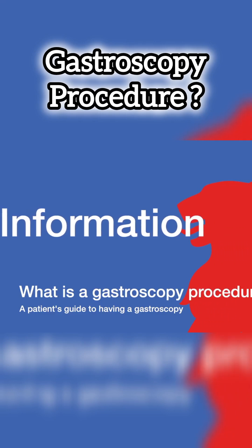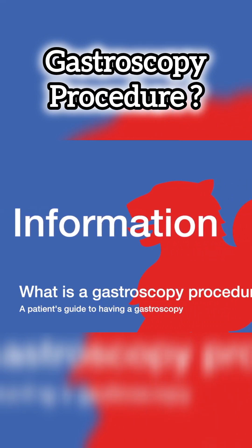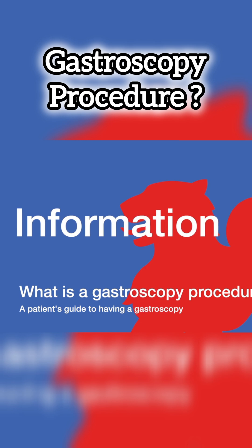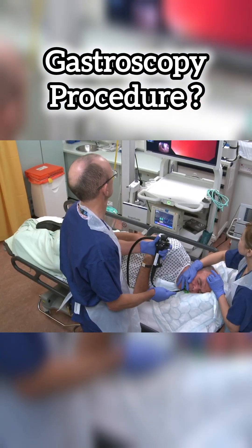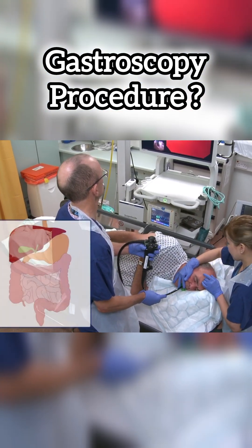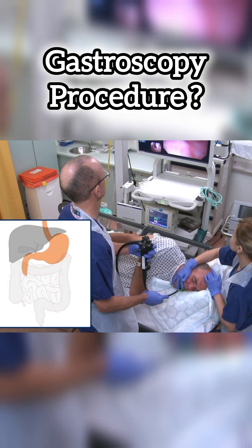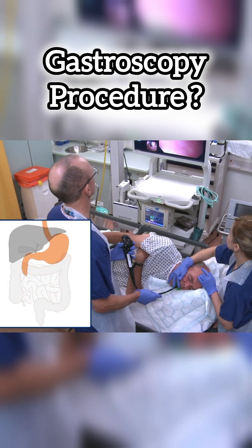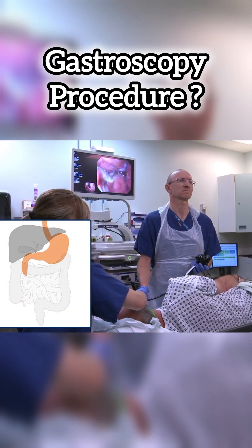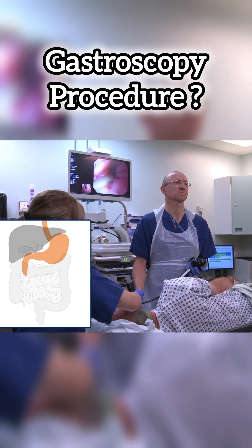Information for patients. What is a gastroscopy procedure? Gastroscopy is an examination of the upper gut, which is the esophagus, or the gullet, the stomach and the duodenum, part of the small intestine joining the stomach.